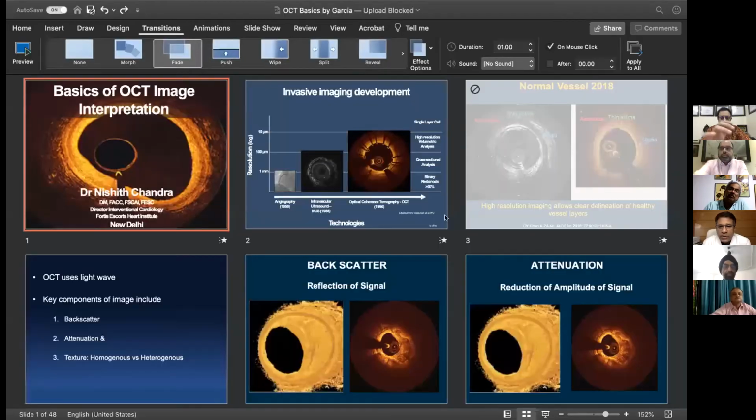So what this session is about, as Narendra has already told us, is invasive imaging. It is following a session on non-invasive imaging, a very good session, on CT imaging, PET scanning and SPECT. But now we have extended this imaging into our cath lab, by intravascular ultrasound and by OCT.